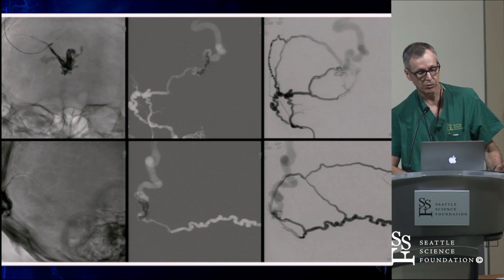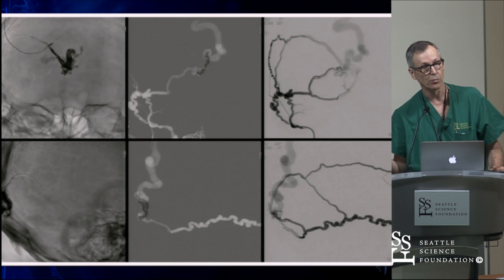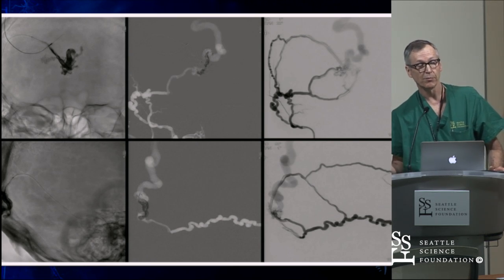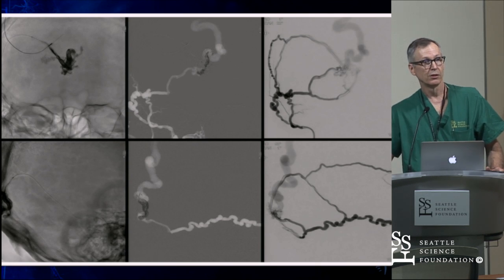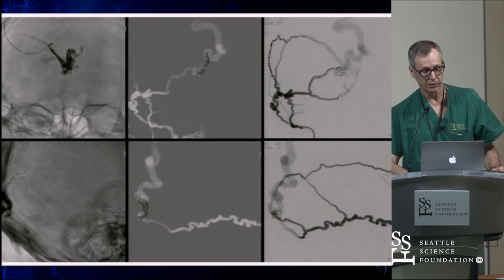If Michael was there, or this guy's surgeon somewhere else wanted to open that surgically and put a clip there, that would be fine. It's just that it would be a pretty unpleasant opening because he's got so much vascularization of the occipital bone and things like that. It would be fairly miserable. But one clip across that vein would take care of it.